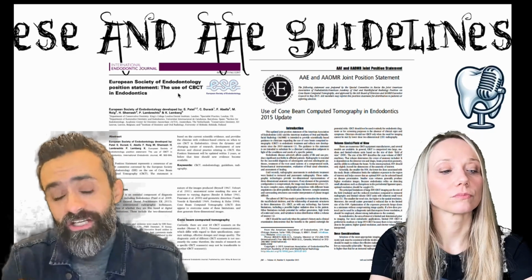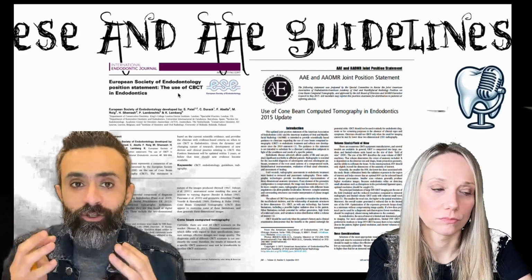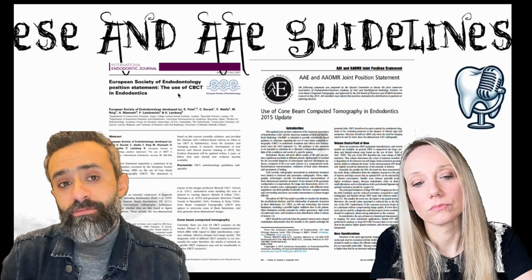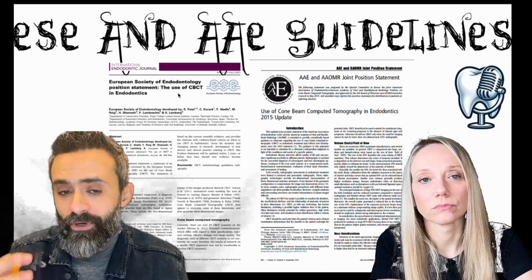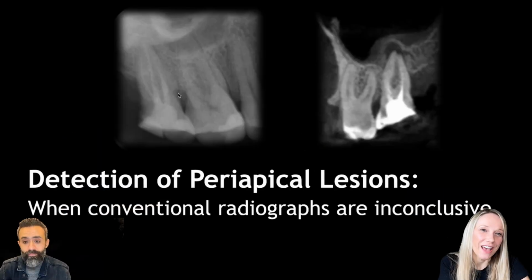So, Francesca, regarding the first and most important indication that really makes a difference between the 2D imaging and that imaging tool, the CBCT, let me ask you, is it possible to detect early stages of apical periodontitis or periapical lesions on conventional two-dimensional radiographs? Well, not every time.